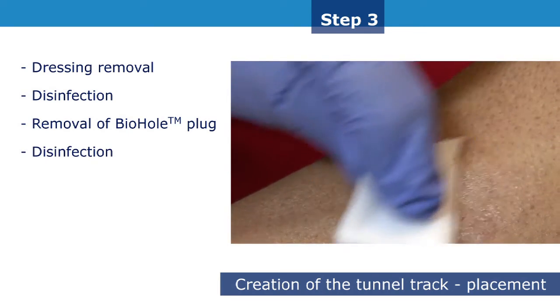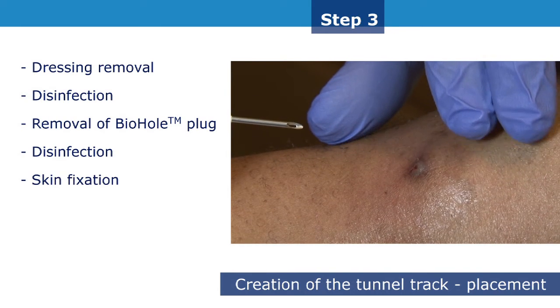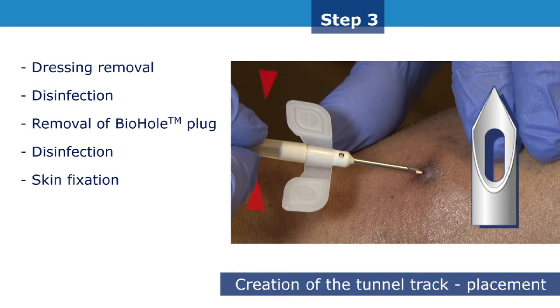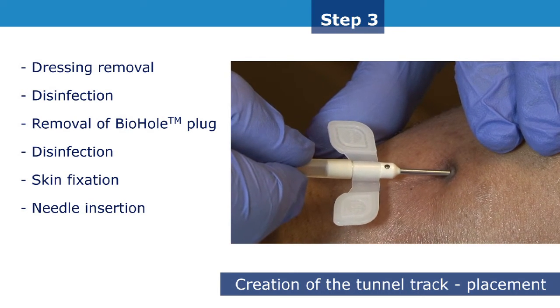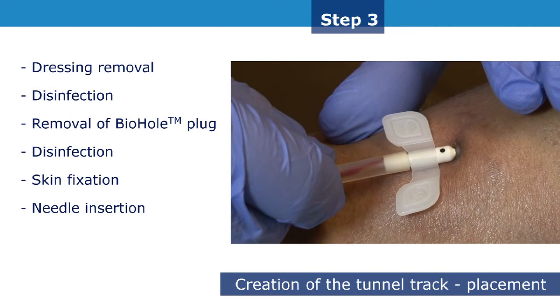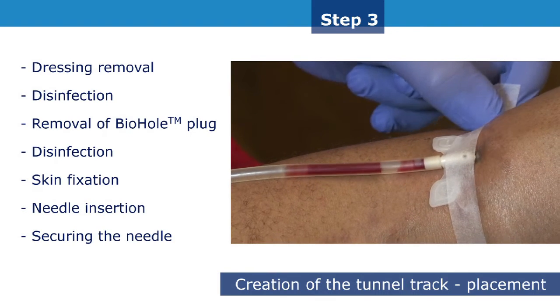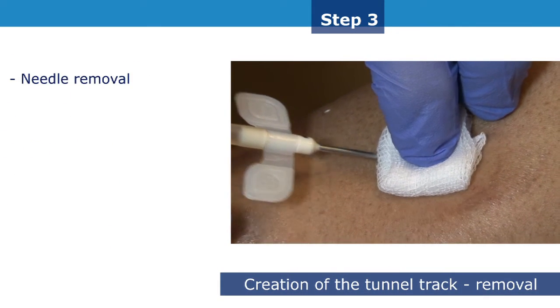It is important to re-disinfect the puncture site at this stage. Keep the skin taut without pulling while carefully sliding a sharp needle through the track left open by the biohole plug, preferably holding it by the tube. It is important to insert the needle into the exact same spot as the first cannulation, remembering that the angle of insertion must be the same to continue creation of the scar tissue tunnel track. Always secure the needle. At the end of dialysis, remove the needle at the same angle as the angle of insertion.